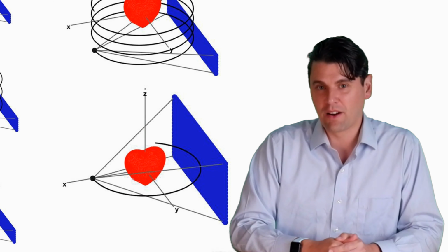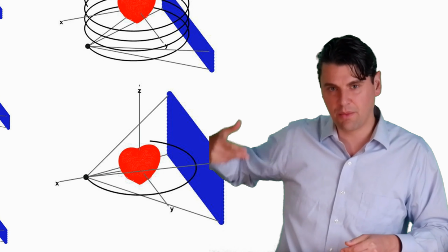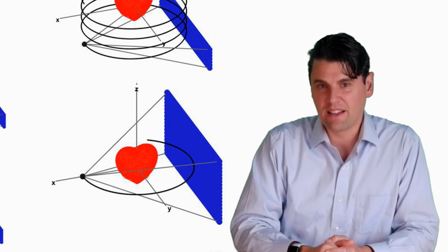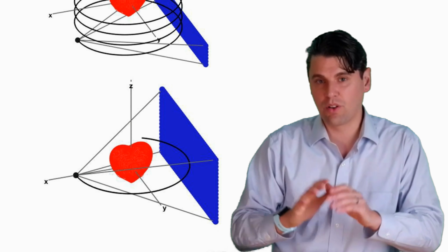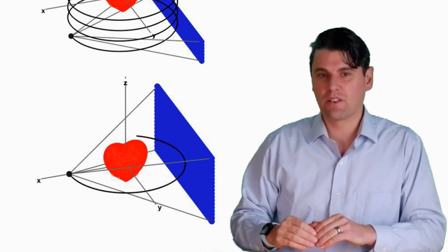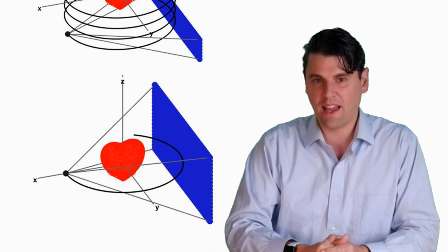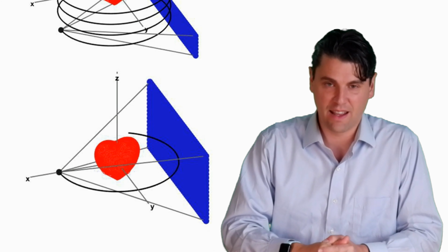If you're in the wider coverage helical scanning, it's really good for covering really long ranges because you can just have that moving continuously. And when you need to either deposit more dose or have higher spatial resolution in the Z direction, you might want to go to a lower pitch scanning. When you need it to be very fast, you can go to a higher pitch scanning.